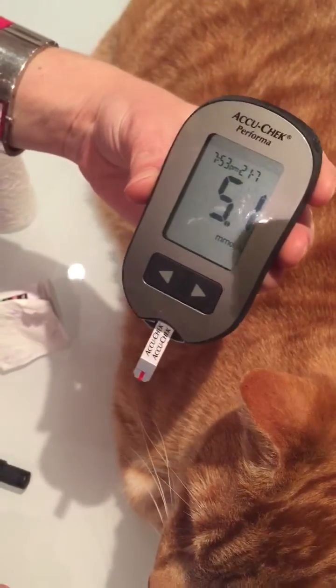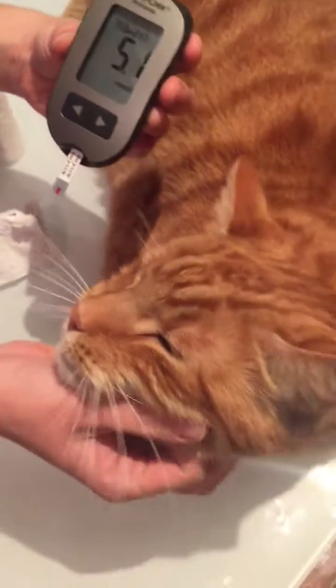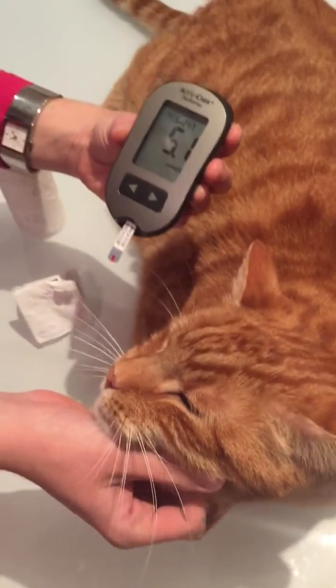Wow, he has a great result tonight. Good boy! And that's it. Thank you.